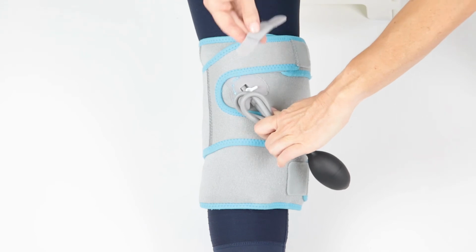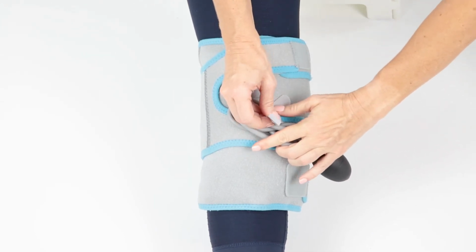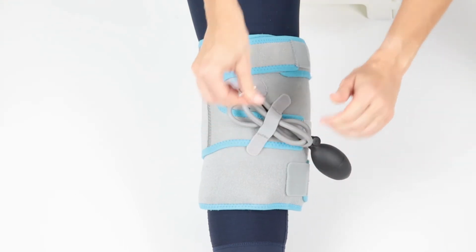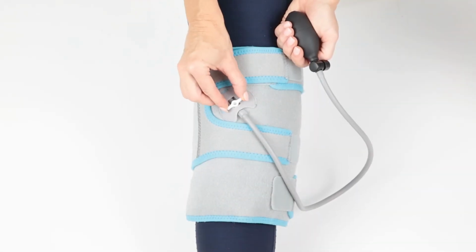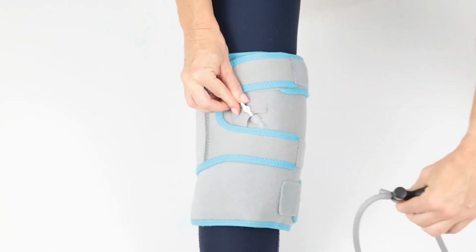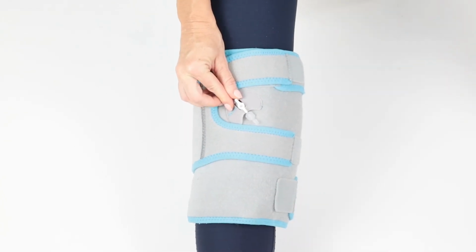If needed, use the included detachable fabric strap to secure the rubber hose and pump to the brace itself. For quicker air release, set the valve to open and detach the rubber hose from the valve. Manually push the air out with hand pressure.